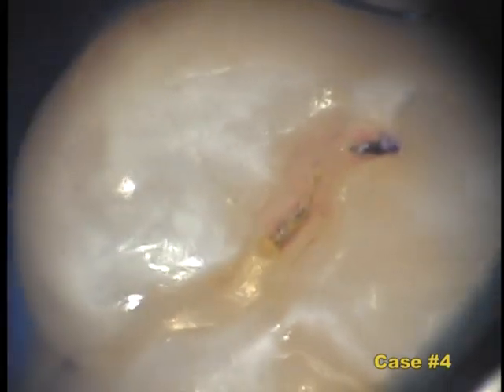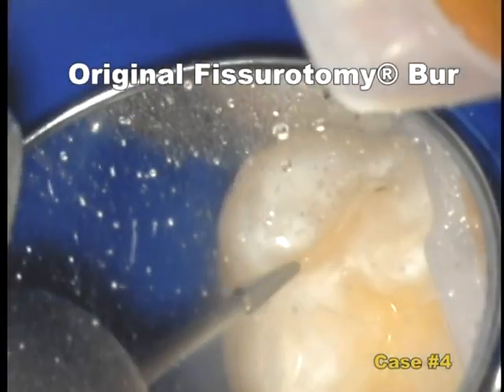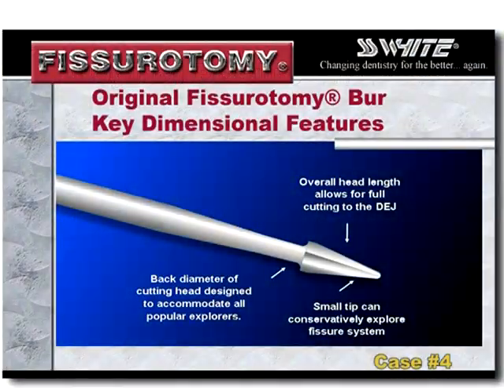On this final case, case number four, I am demonstrating the use of the wider of the fissurotomy burrs, which I prefer when removing old sealants and composites. It has a rounder end that has better end cutting potential.